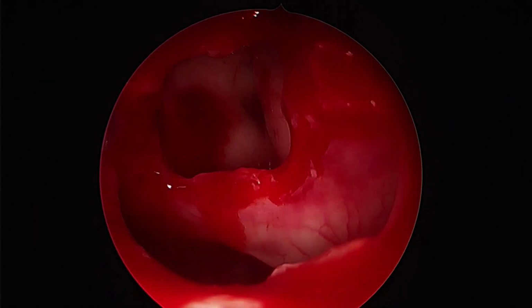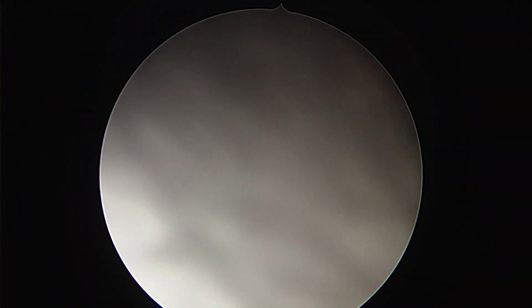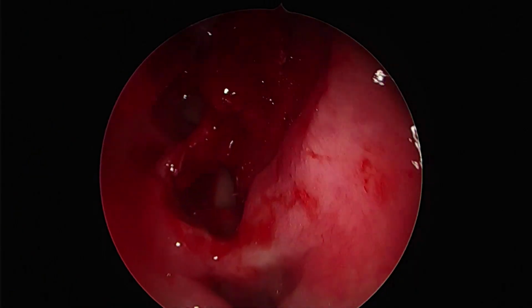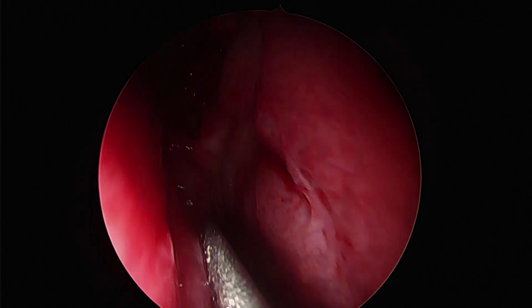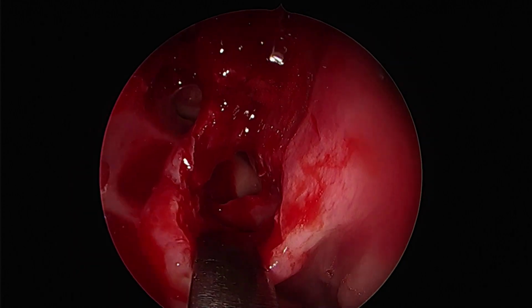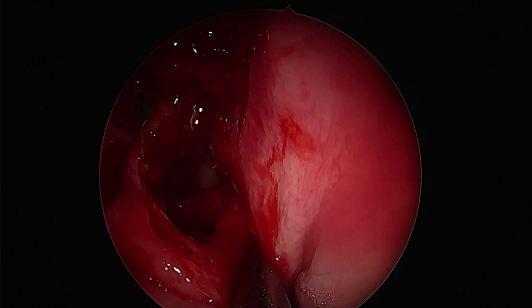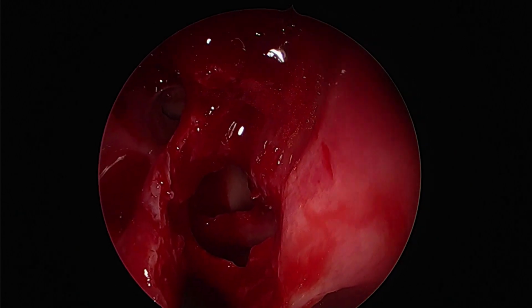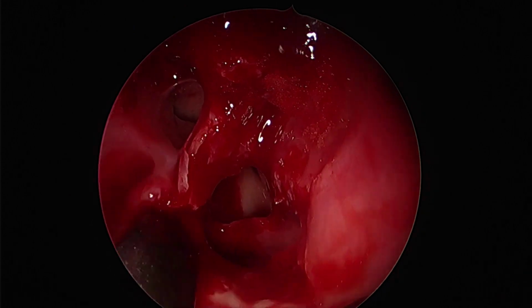Though this much opening looks adequate, and courtesy the steroid use the Onodi seems to be clear now and the polyps seem to have regressed, the goal of surgery is to remove all septations for the patient to use ample amount of irrigation to prevent further recurrences. Since that function was achieved well in the previous surgery on the anterior ethmoids, the same has to be done for the posterior ethmoid and the Onodi, and this opening needs to be enlarged further.